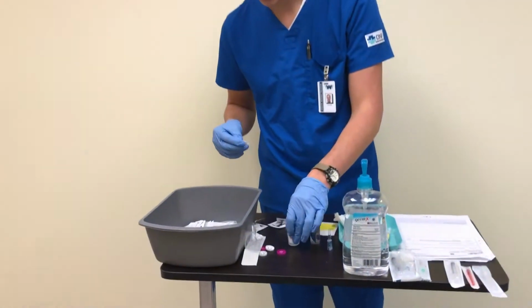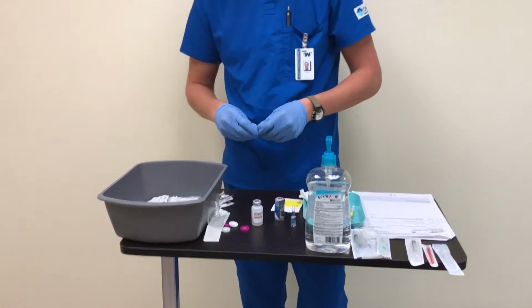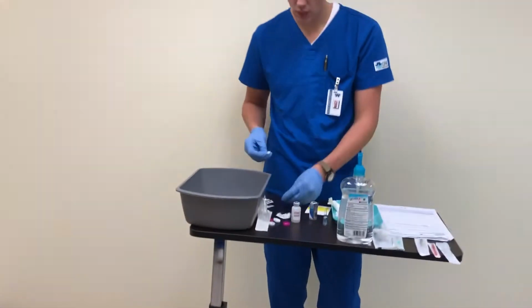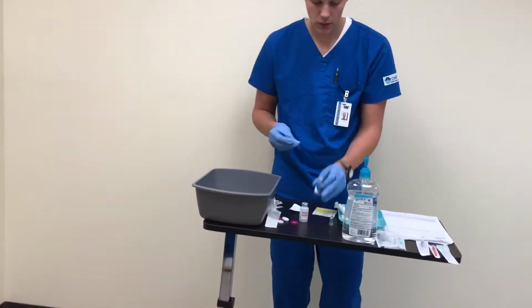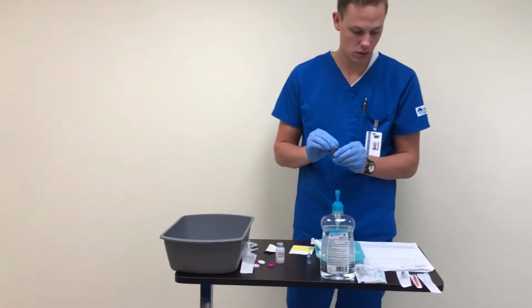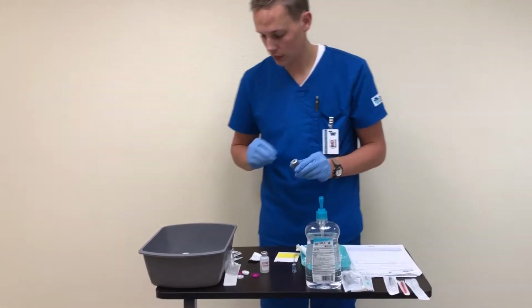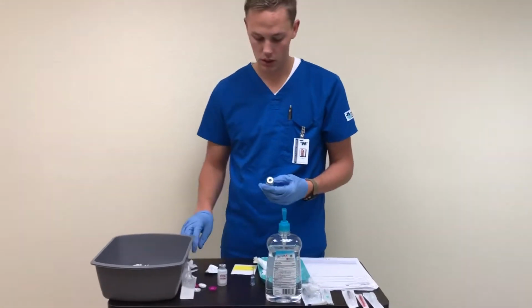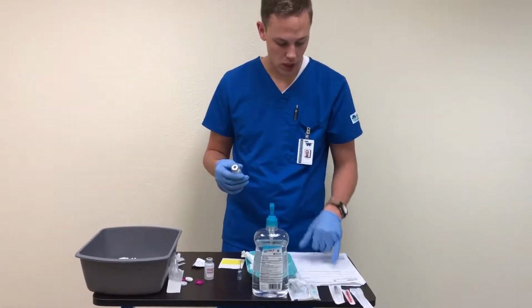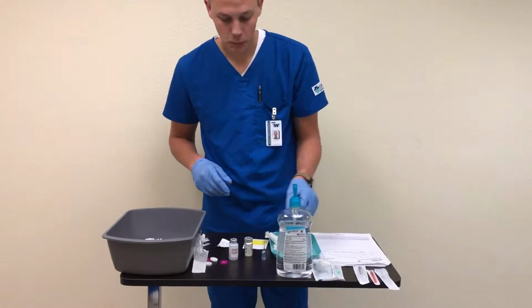So there's the sterile water wiped down. And next we'll go on to the medication. And that's for 10 to 15 seconds as well. And again, just to confirm my second med check, it's ceftriaxone, 250 milligrams.